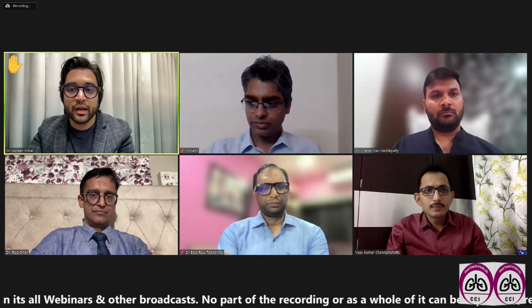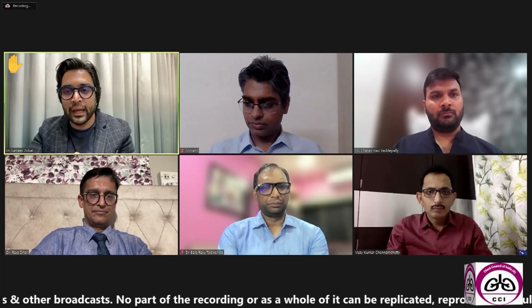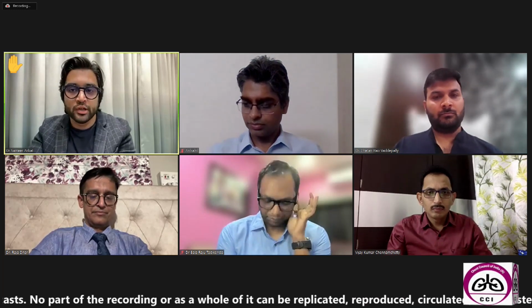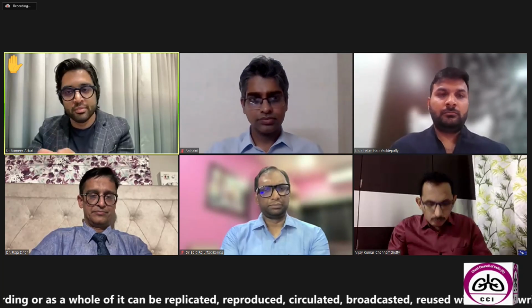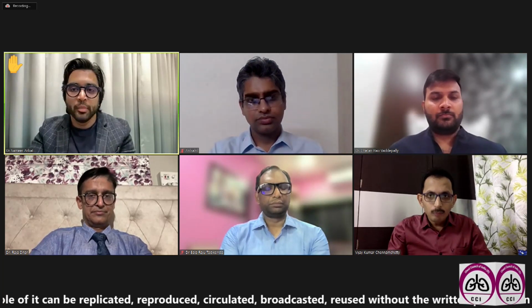And as Dr. Bala Raju said, if you're keeping the balloon inside, there's a fair chance the balloon will either compromise the lumen or get displaced from its original position. So the rigid bronchoscope is not really a rigid bronchoscopy. It's just a rigid bronchoscope barrel, which is used for ventilation and as a conduit for the scope to come in and go out.